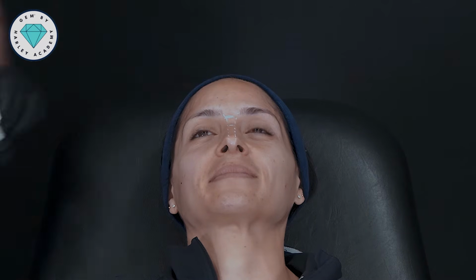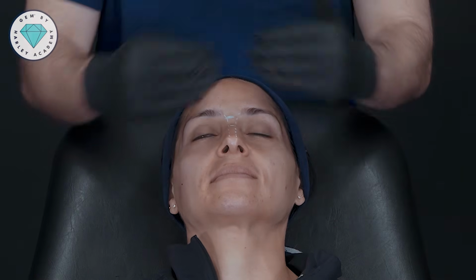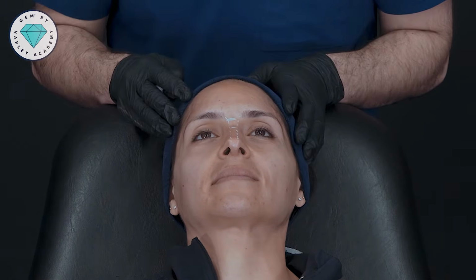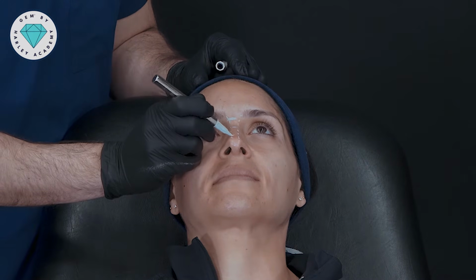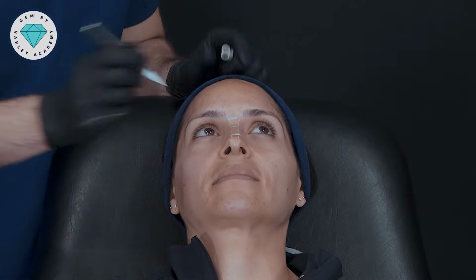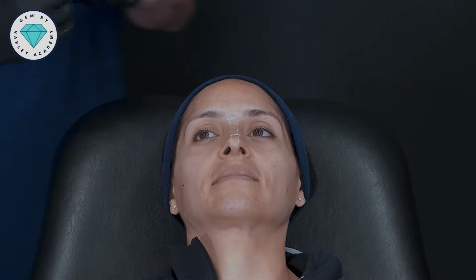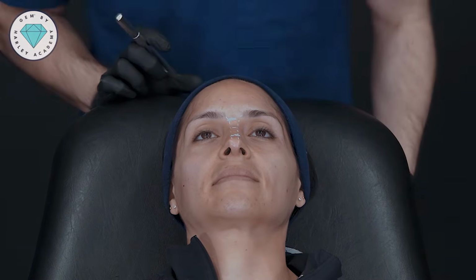So I have to use a 25 gauge cannula, because a 22 gauge cannula doesn't seem to work in the tissue planes where we've got a very tight envelope of the nose. The other thing I want to mention is that in the bottom 30% of the nose, we don't have our concentric 5-layered structure, and so we have just a cartilaginous tip without any hierarchy of the layers of the face.